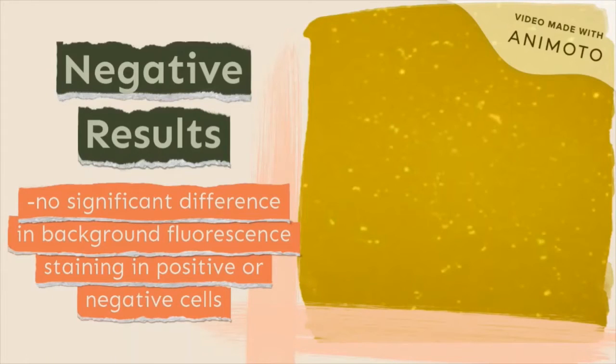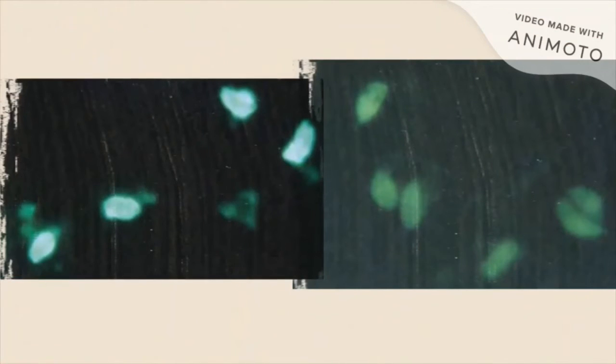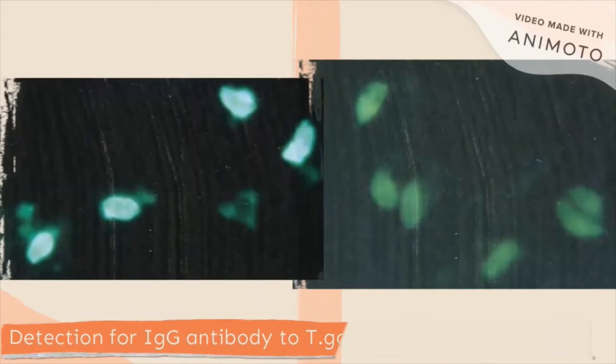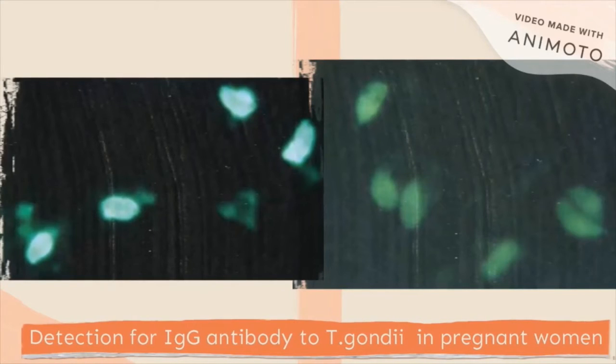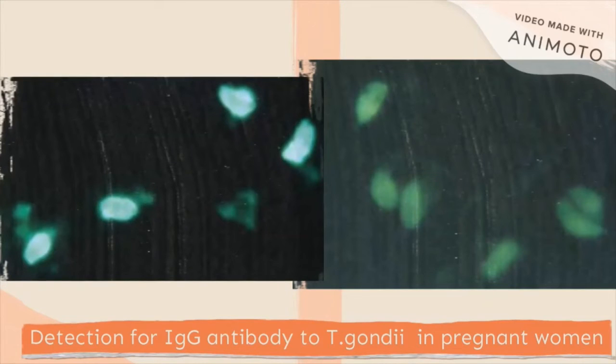The diagram on the left-hand side displays a positive reaction of detection for immunoglobulin G antibody to Toxoplasma gondii in a pregnant woman, with a bright and greenish-yellow color. On the other hand, the diagram on the right-hand side shows a negative result with non-fluorescent staining. For your information, Toxoplasma gondii is a protozoan parasite that infects most species of warm-blooded animals, including humans, and causes the disease toxoplasmosis.